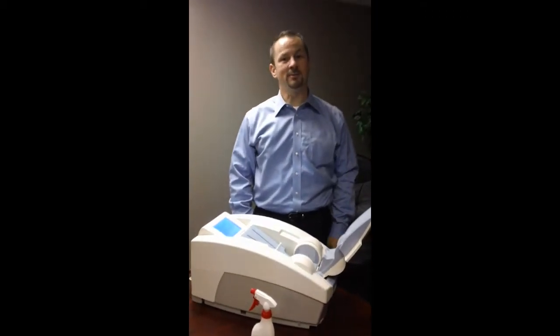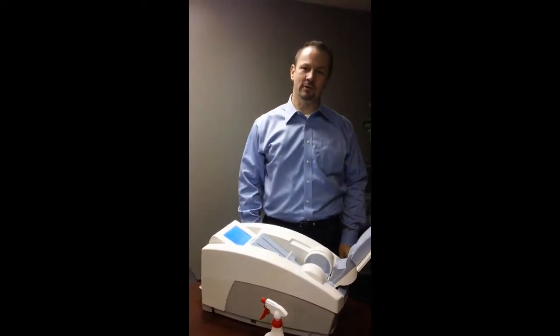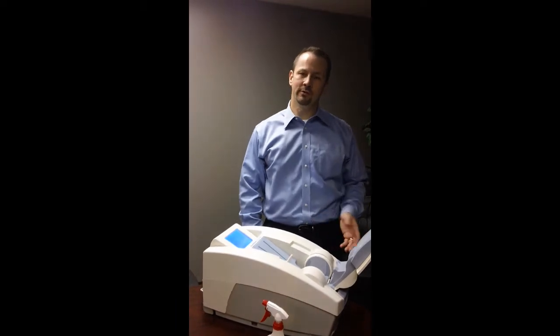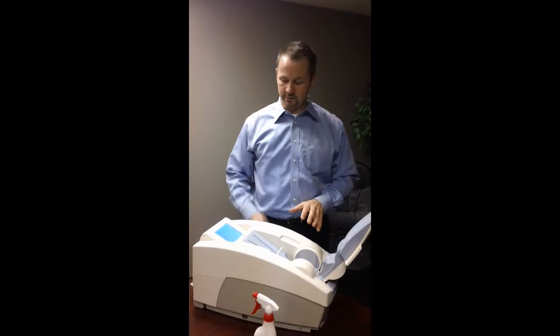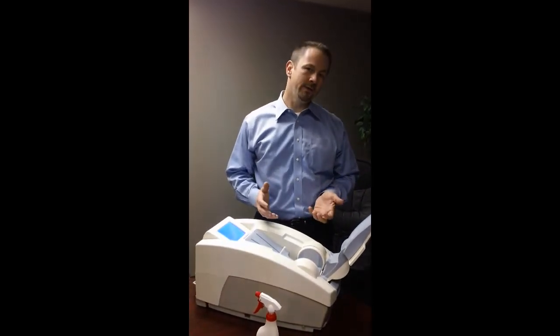Good morning Chris and Dr. Geddings. My name is Jeff Greed. I work with Complete Medical Service. We're the licensed reseller for Lunar in the United States. I have an Achilles here with me. I'm at our corporate office, and what I wanted to do is just a quick run through on the Achilles unit.